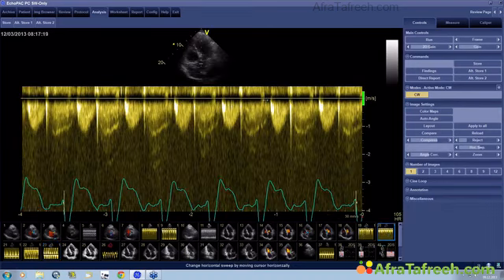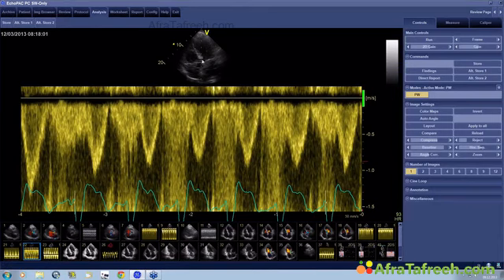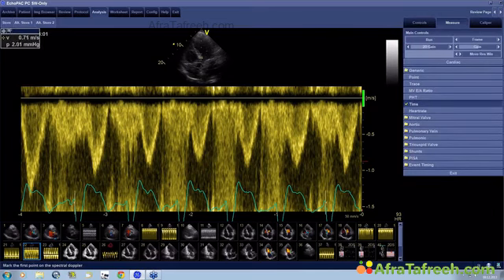Here we go. Now this is the same thing in the 4-chamber view. Now we look at the measurement across the aorta. This is a continuous wave. I think this is better here. Okay, this is a pulsed wave now in the LVOT. And again, we measure the distance from begin of the QRS complex to the begin of outflow. Okay, and then we get a measurement of 188 milliseconds.